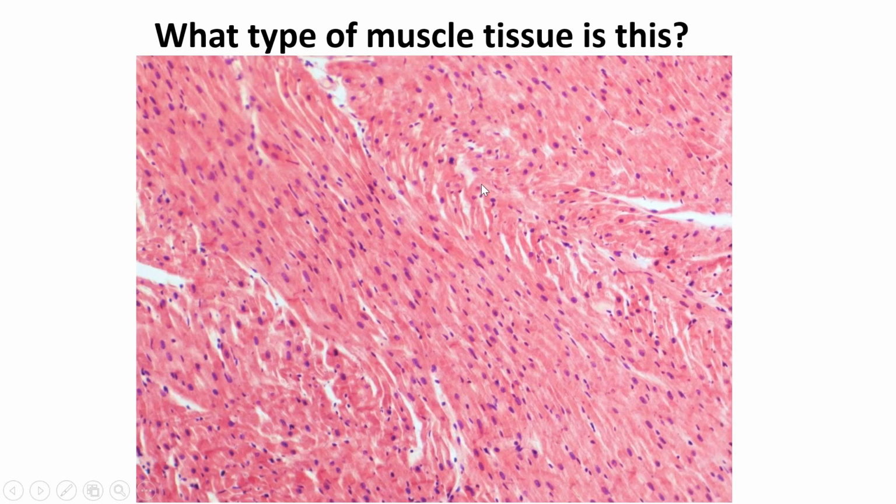So now the question is what is this? What type of muscle tissue is this? So if I go along here, this is fairly longitudinal right in here.